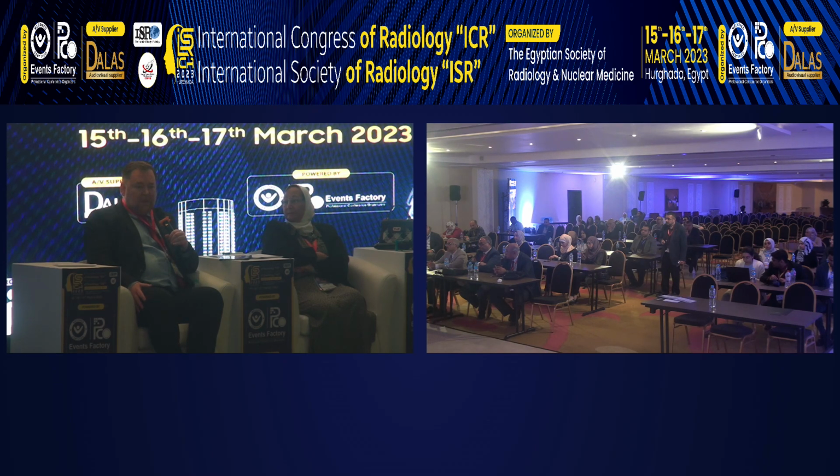The use of PET-MR, it is my personal opinion, is actually not that necessary, because PET-MR, as with any machine, you are combining something with something. You have some technical compromises you have to make. And from my perspective, as an imager, as a diagnostic person, it's not that important for me whether I have one image from one machine or two machines, and I can combine them with fusion software.